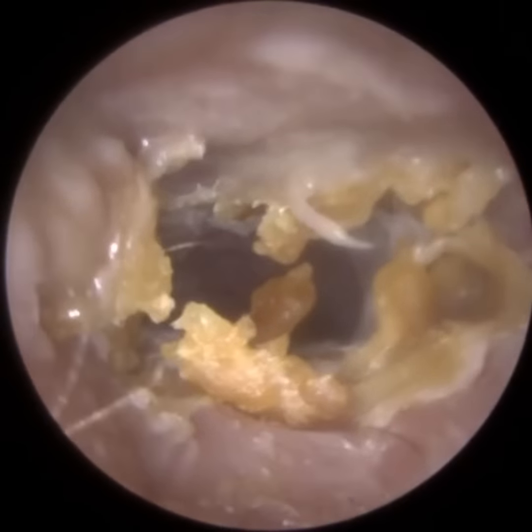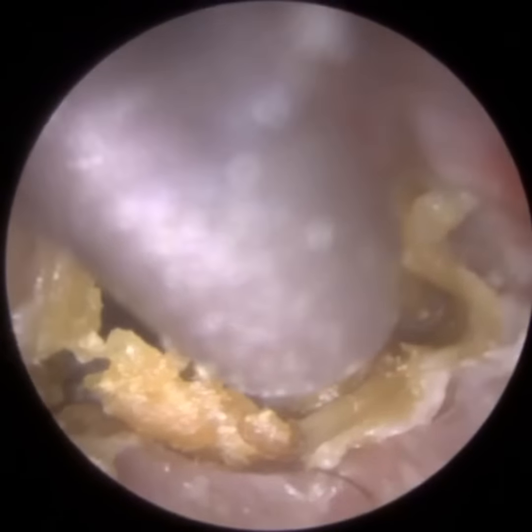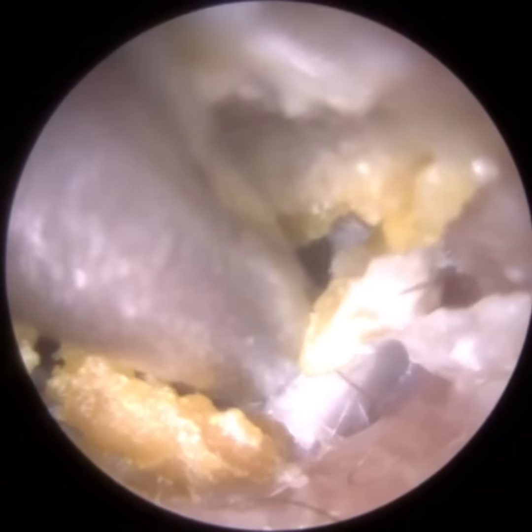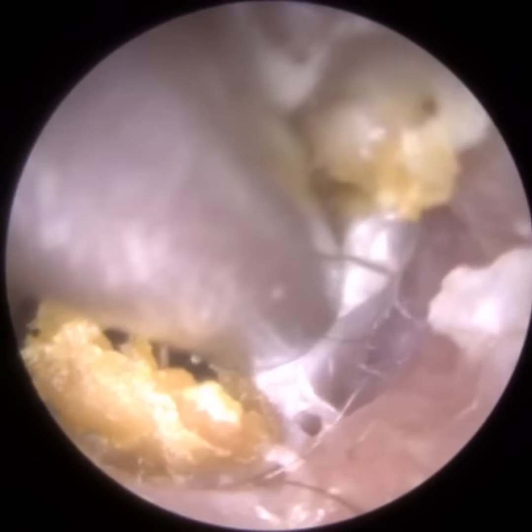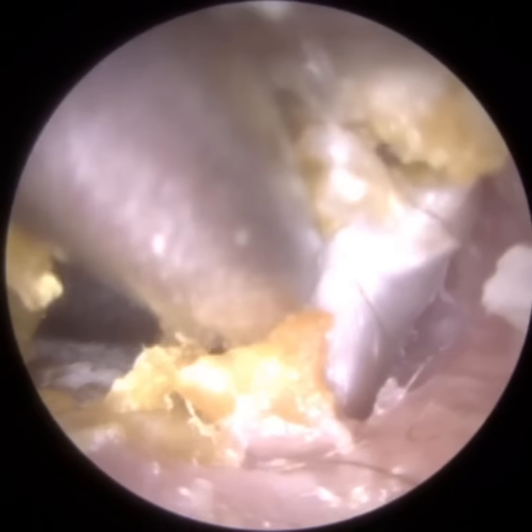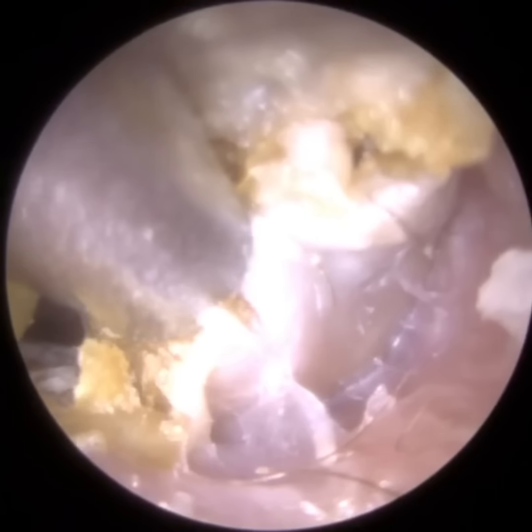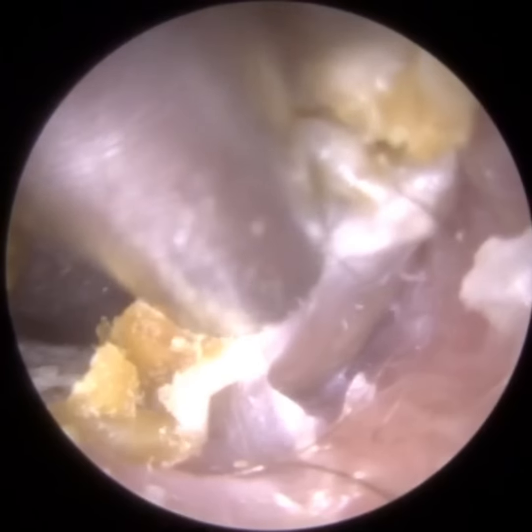Sometimes when you're doing suction, you can suck the granulation tissue out of the ear. Quite often it's cauterized by ENT doctors. They use silver nitrate and they cauterize it, so essentially burning that connective tissue, preventing it from growing anymore. And once you've burnt it, the ENT doctor's hoping that you'll get a normal regrowth of skin as opposed to the granulation tissue. So at this stage, the patient's symptoms are more or less alleviated.